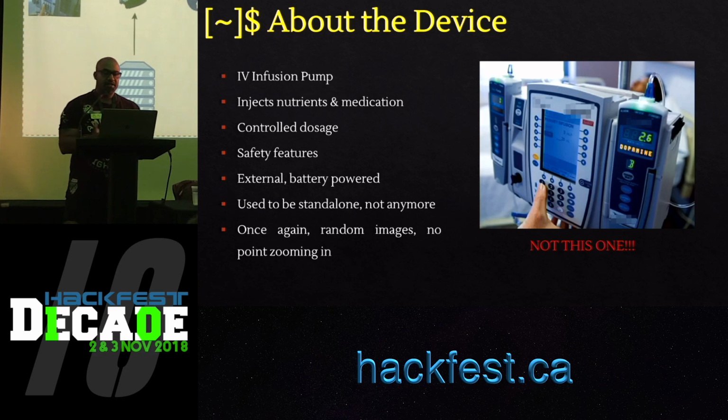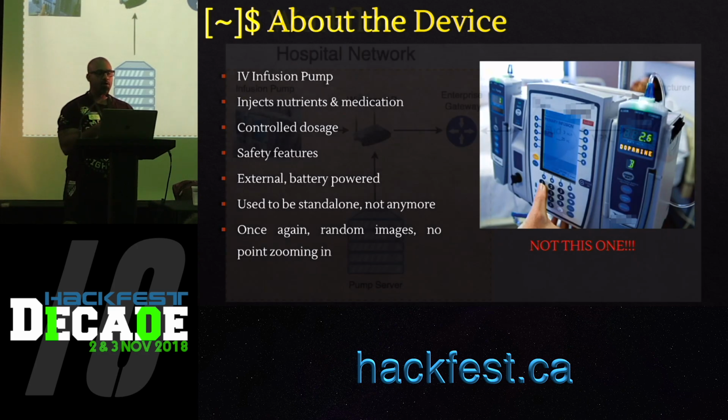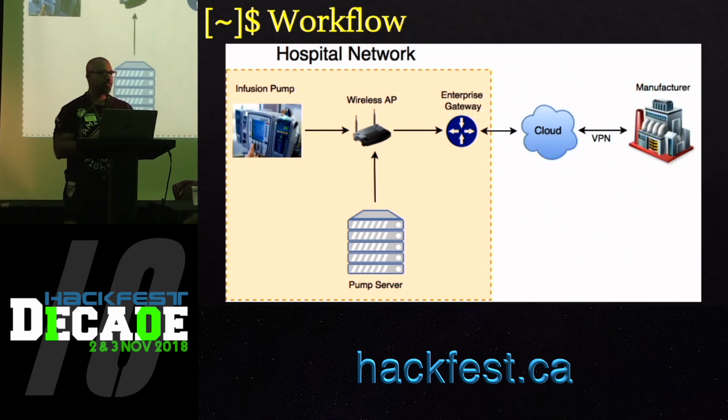In terms of architecture, this is what an infusion pump would look like in a hospital network. It will connect to the hospital network either via Ethernet or wireless. It will talk to different subsystems on the hospital network. The pump server is something the infusion pump often talks to, to retrieve configurations and then save data onto.